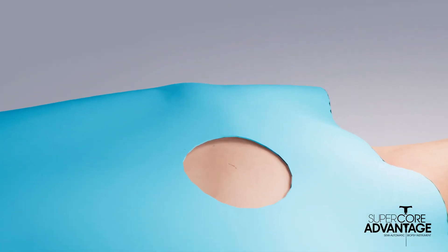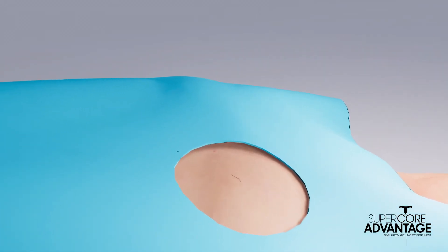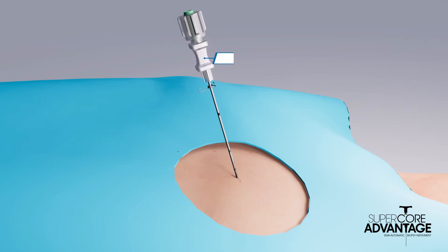After appropriately preparing the biopsy site, the target area is located. To minimize force required to puncture the skin, a skin nick may be desired. Using standard technique, the SuperCore Advantage coaxial needle is advanced to a position proximal to the lesion. The adjustable needle stop is then located in an area proximal to the skin, and the stylet is removed from the coaxial needle with the cannula left in position.